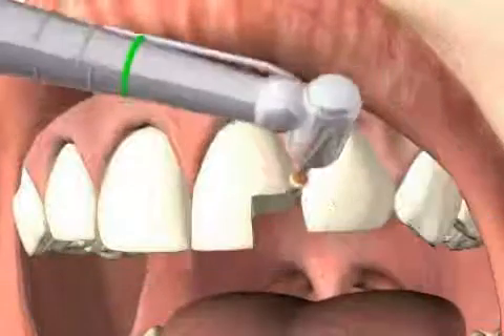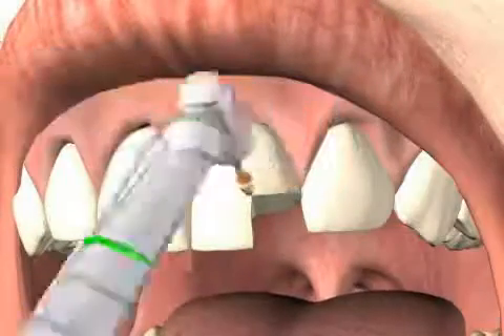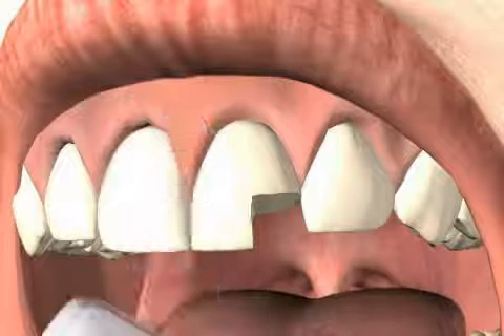You will get a better result when smoothing enamel with an Arkansas stone at the end of the grinding process. The smooth edges isolate much better with the gold inlay.